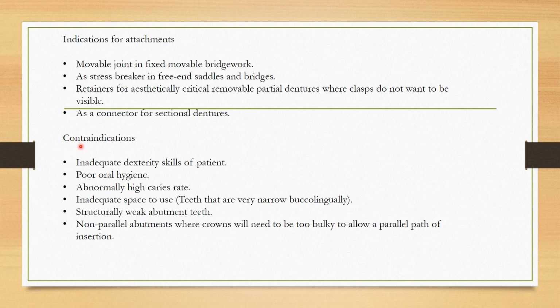Coming to the contraindications: when there are dexterity issues with the patient, the patient will not be able to remove and place it back well.